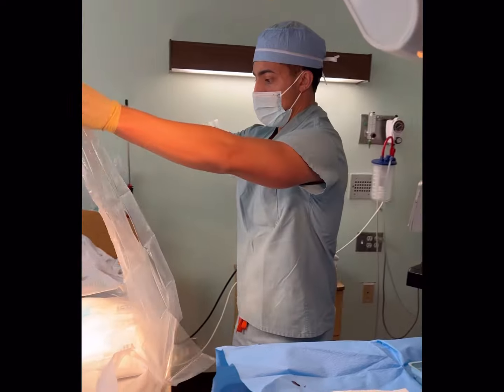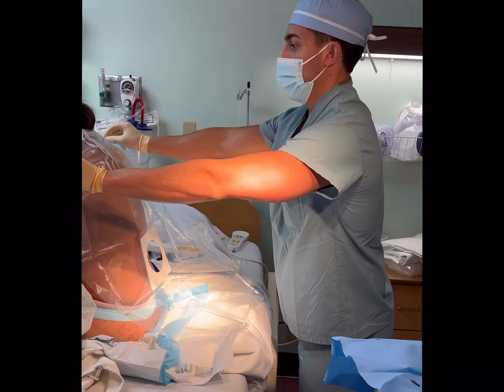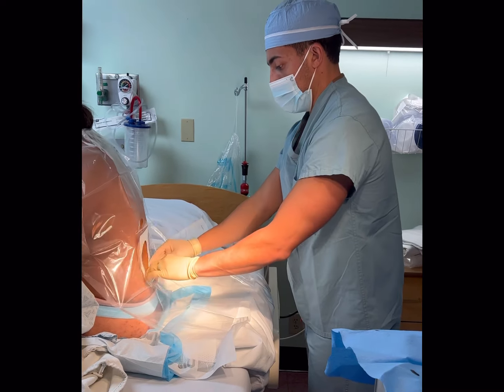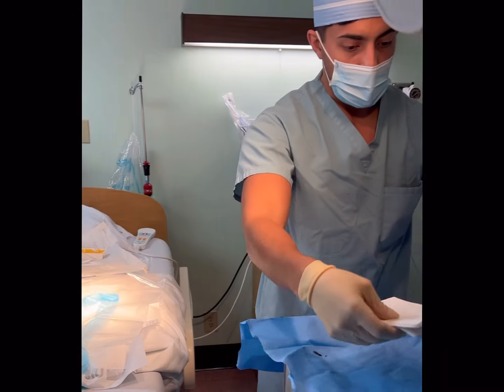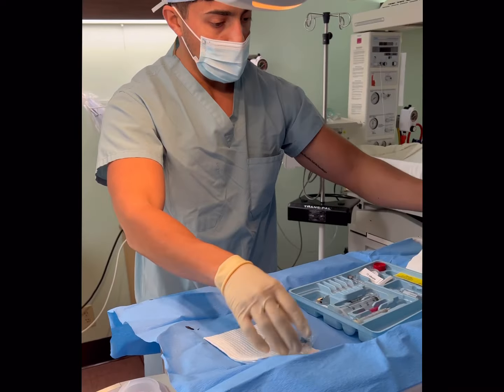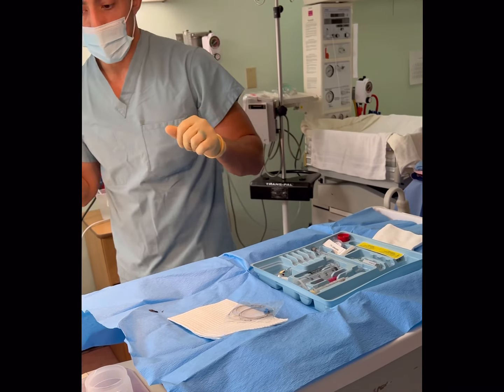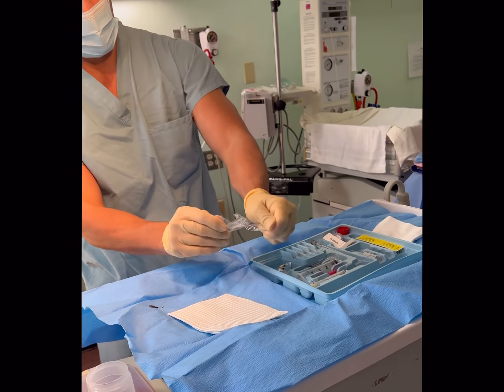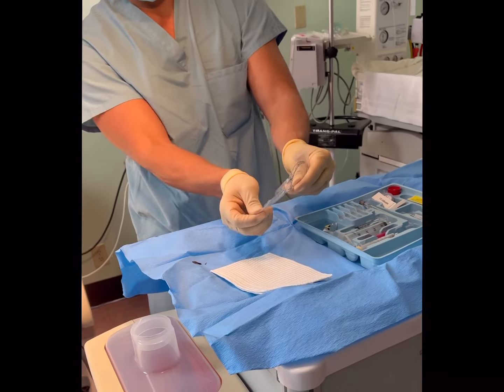I try to do a bullseye with her right there, and you just place this drape and hope it sticks — which looks like it did nicely. So that's where I'll be working. I like to get rid of things that I won't use. Can you open that up? I forgot to open it — you might have to come around and just drop it on the tray.